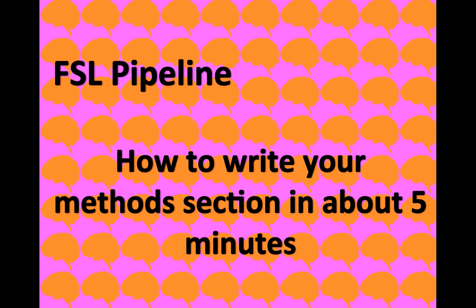So it turns out this is pretty easy to do with FSL because everything's there. And you can write it in approximately five minutes, maybe a little bit longer. Definitely once you've done it one or two times, it'll come pretty quick. So I just wanted to show you how to do that.